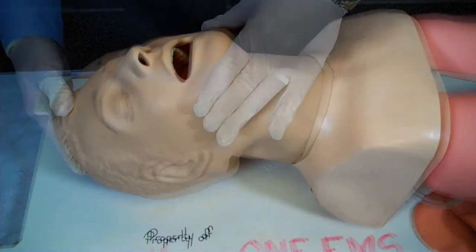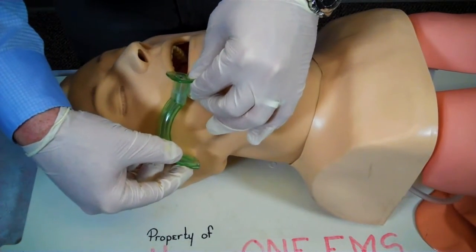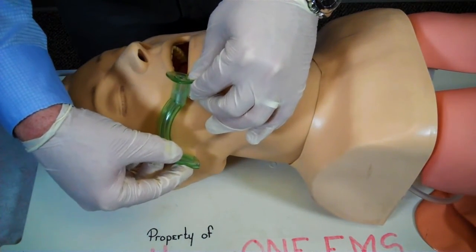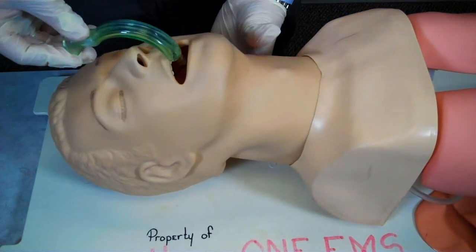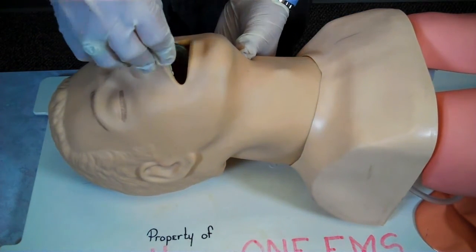I will measure the oropharyngeal airway from the corner of the mouth to the earlobe. I will insert the adjunct into the oropharynx in a manner that will not push the tongue back into the patient's airway.